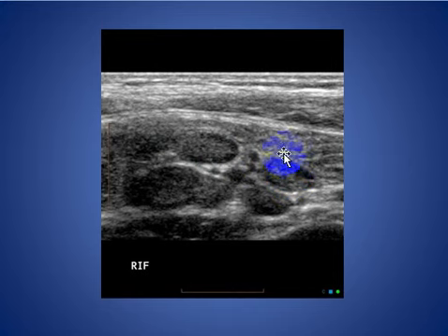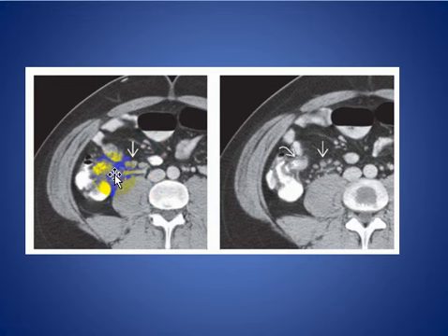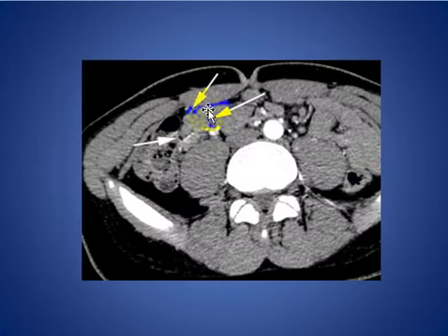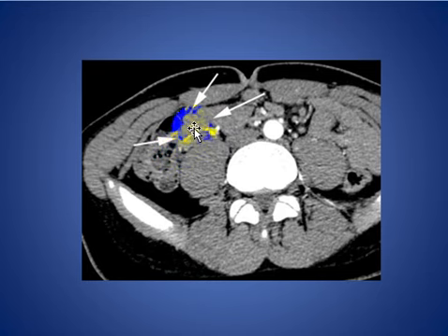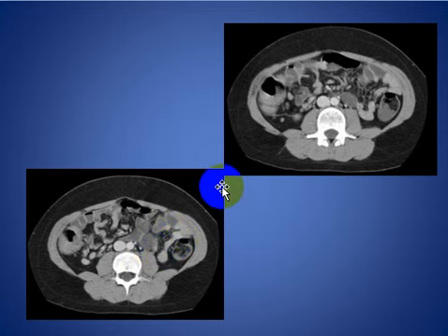Another patient with mesenteric lymphadenopathy on ultrasound. Here is a 20-year-old woman with right lower quadrant small multiple lymph nodes associated with bowel wall thickening due to infection. The appendix in this patient is normal. Here is another patient with right lower quadrant lymphadenopathy consistent with mesenteric lymphadenitis. Here you see right lower quadrant lymphadenopathy associated with bowel wall thickening, most likely infection, which resolved after treatment.